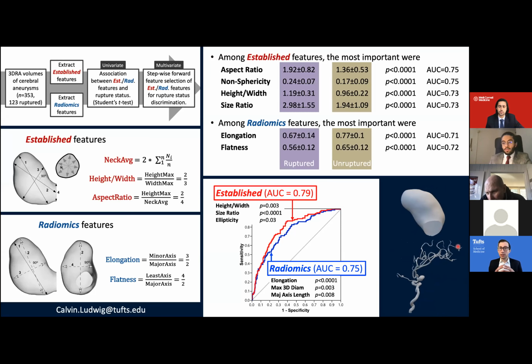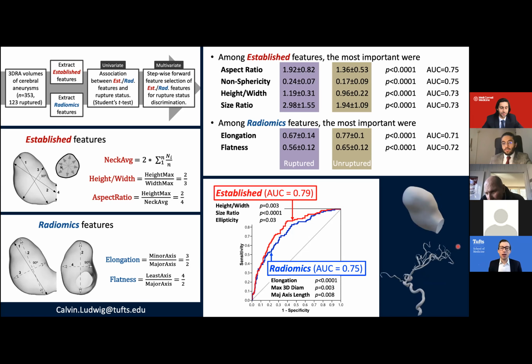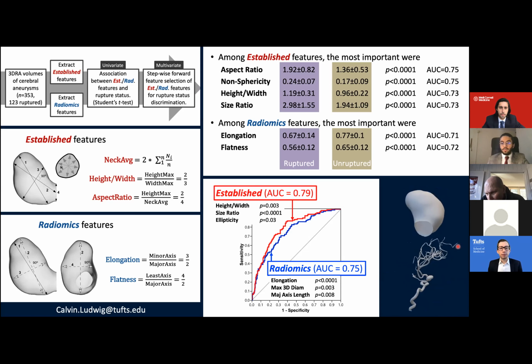I'm only taking a look at the shape, the three-dimensional shape of the aneurysm. We're not yet at the point where we're looking at the elastic nature of the wall of the aneurysm or the thickness of the aneurysm. These are all features that could be very relevant and how the aneurysm changes in real time. But no, for this, it was just shape. Do you believe that this methodology can be enhanced over time to create some measure of variations in elasticity of the wall?